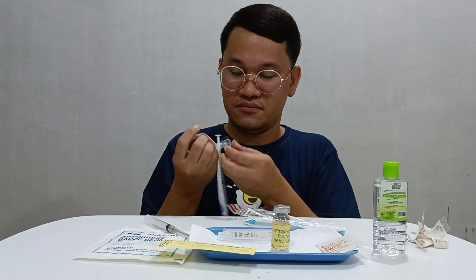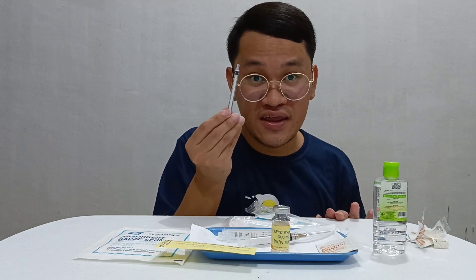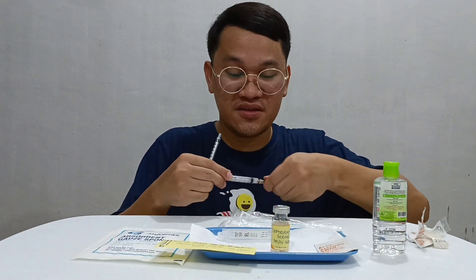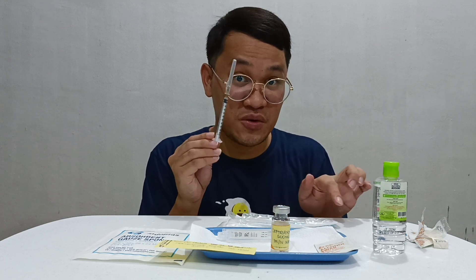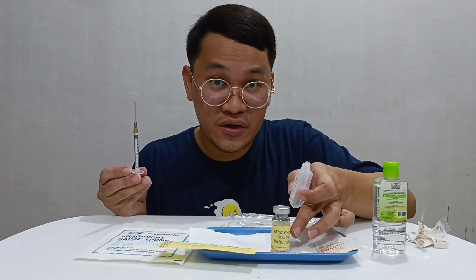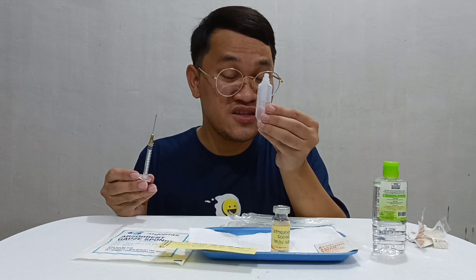I will do it intradermally. I'll get my barrel for that one. For this one I will be needing another aspirating needle. Assuming that I obtain a new aspirating needle — assuming this is another aspirating needle that I did not use earlier, so this one is new. In your return demonstration, you will be needing a vial like this for the sterile water, which should be obtained from the vial. Assuming that this one is a vial as well.